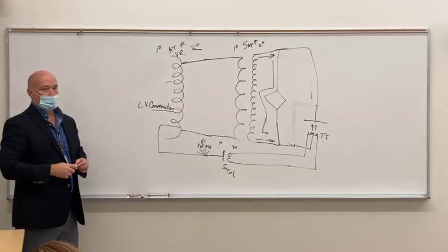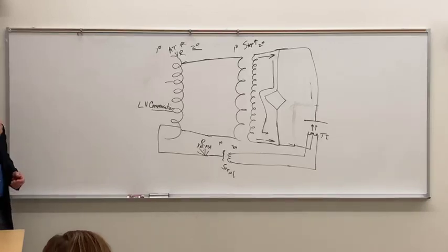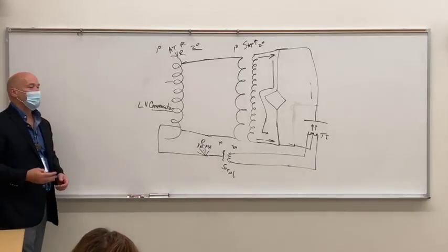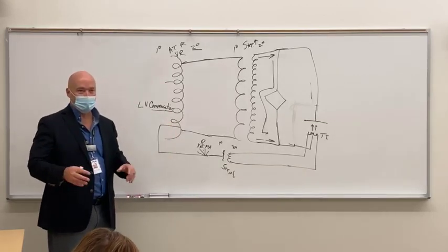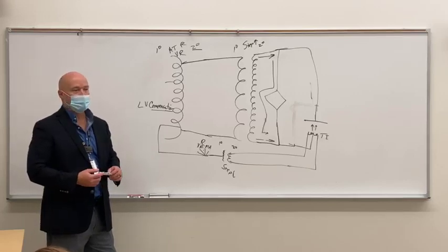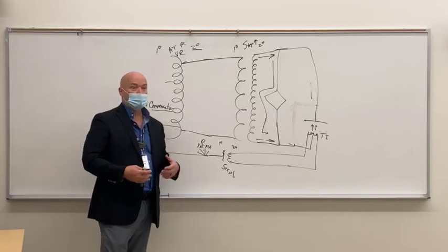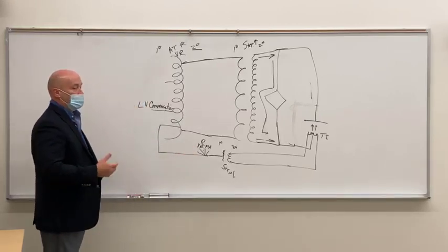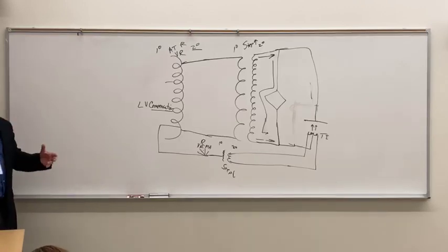So line voltage compensation, how do you manipulate it? It's a trick question. You don't. It's just a circuit that's built into the machines. If you happen to see or work with a single phase machine, you'll see a control for that on the control panel, but chances are you're not, unless you go work for a vet's office or a small doctor's office in the middle of nowhere. But just be aware it's there.